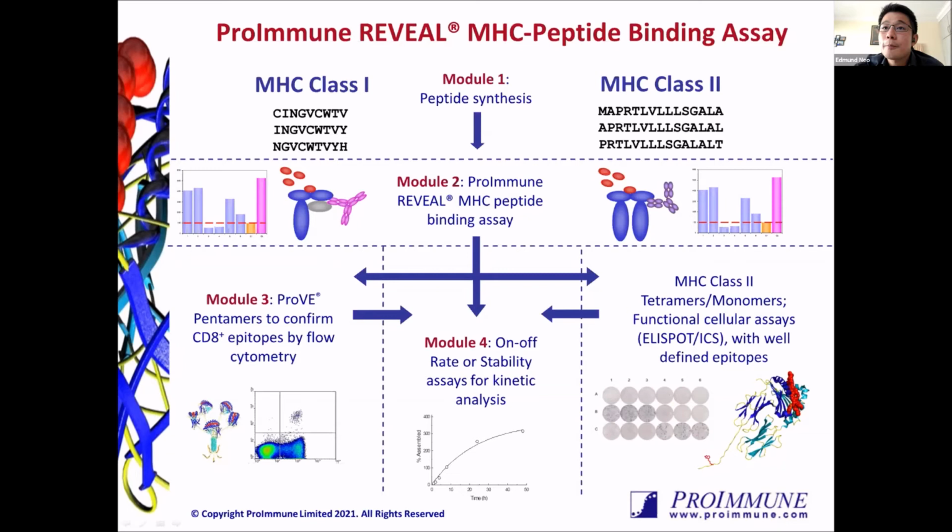Take note that peptides that have high binding affinity do not necessarily have good binding stability. Therefore, at the final step in module 4, we will incubate the MHC peptide complexes at 37 degrees Celsius for 24 hours to assess the stability of those peptide MHC complexes.